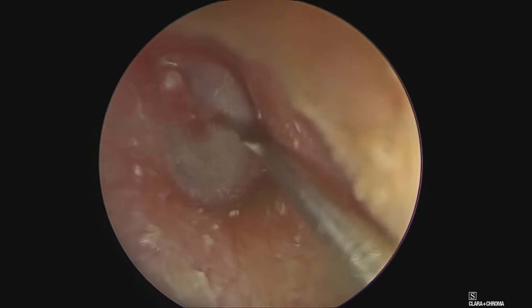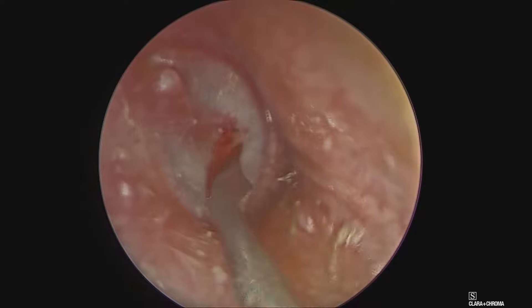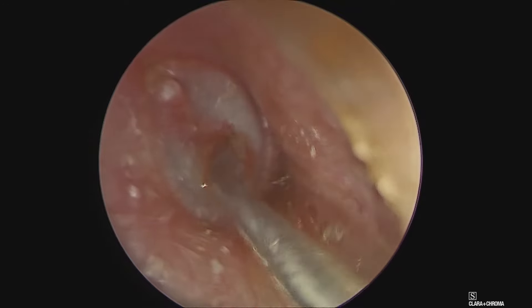This is how the incision can be increased in length and width, depending upon the type of grommet we use. Care has to be taken that the tip of the sickle doesn't hit the promontory, otherwise the mucosal damage will bleed a lot.